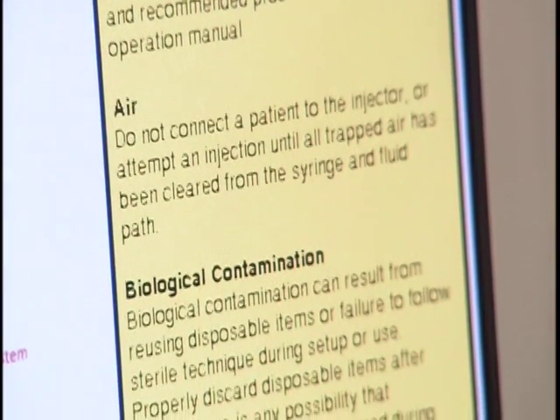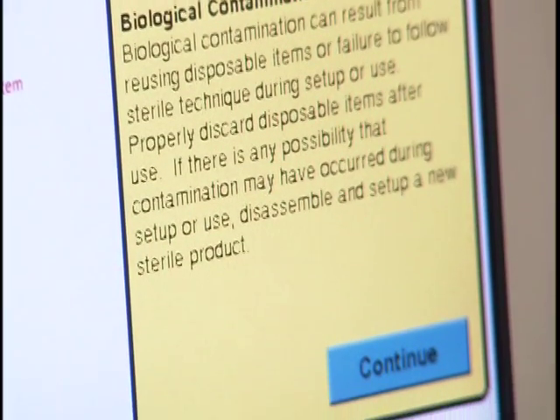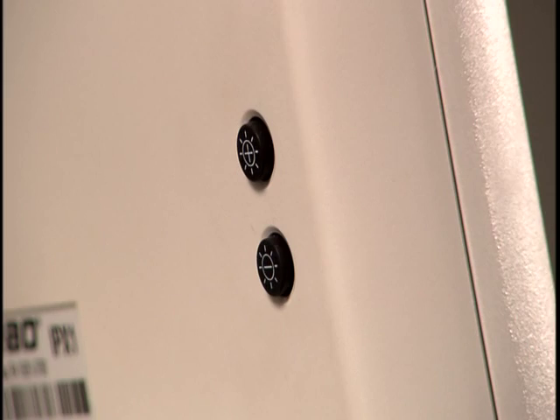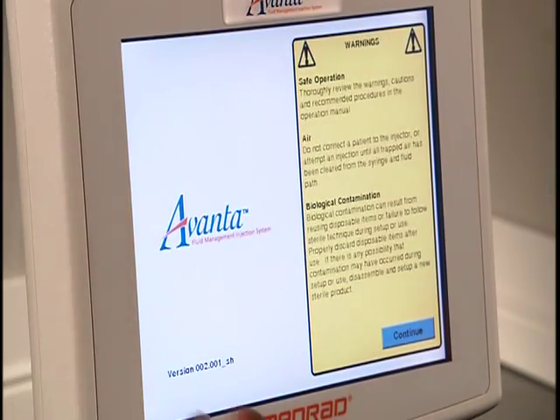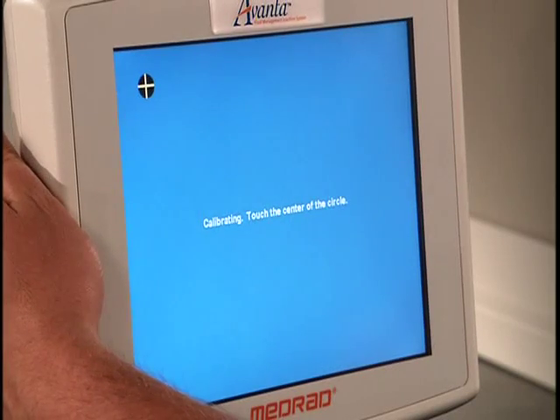If the safety screen indicates a system error, verify that a patient is not connected, record the code, and contact Medrad service. To adjust the screen brightness, press the controls located on the back side of the DCU. The user may calibrate the touch screen when the safety screen appears. Press both brightness keys simultaneously, then follow the on-screen instructions.